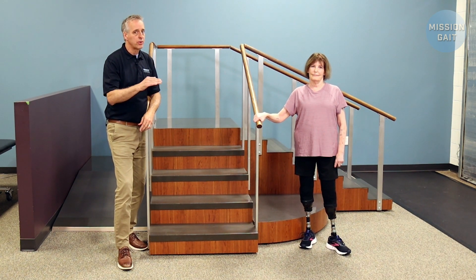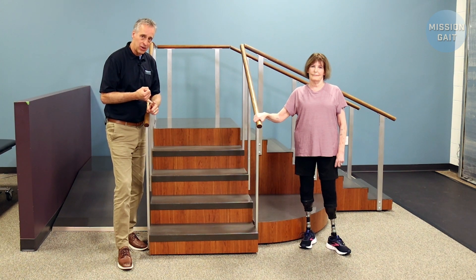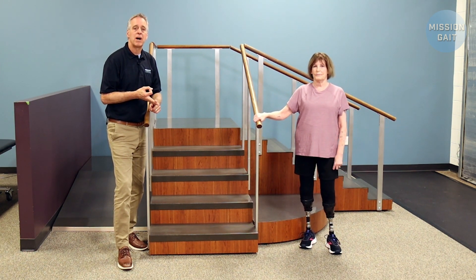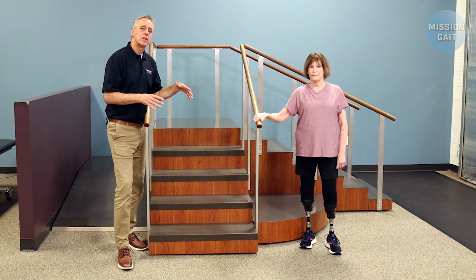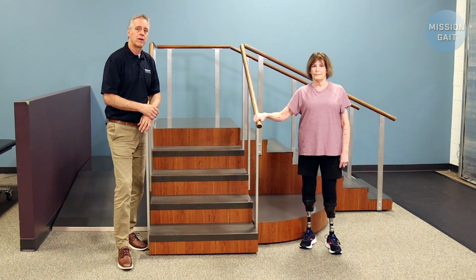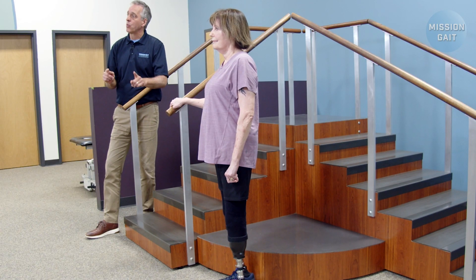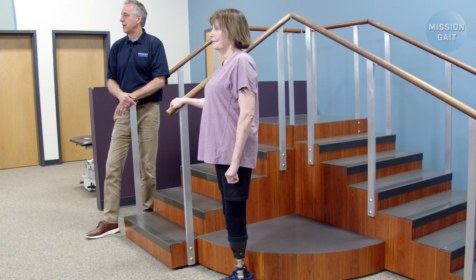In that video, we go through in detail unilateral below the knee, bilateral below the knee, and unilateral above the knee. So we cover most of those things in more detail than we will here. But we're lucky enough to have Stephanie with us today. She's going to demonstrate bilateral below the knee, then we'll talk about and demonstrate one above and one below, and then bilateral above the knee.